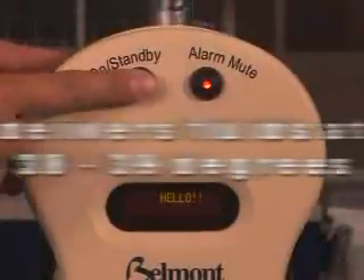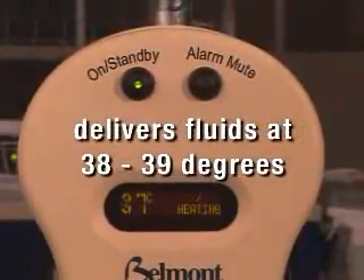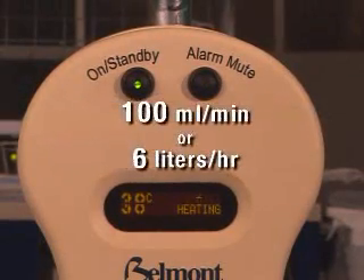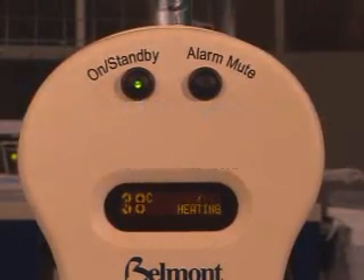The Buddy Fluid Warmer, with its miniature design, solves this problem by sitting close to the patient and delivering fluids at 38 to 39 degrees at flow rates up to 100 milliliters per minute, or 6 liters per hour.